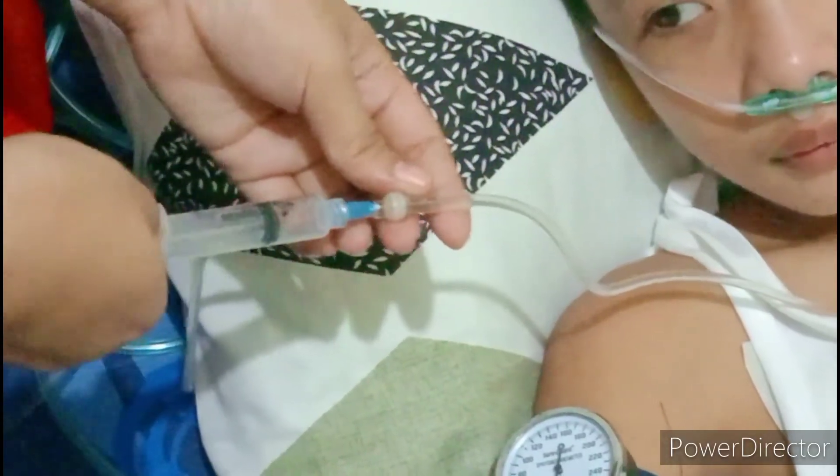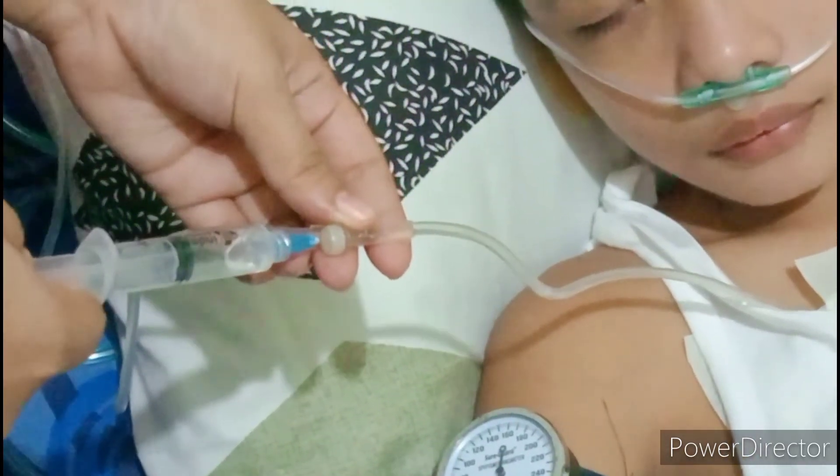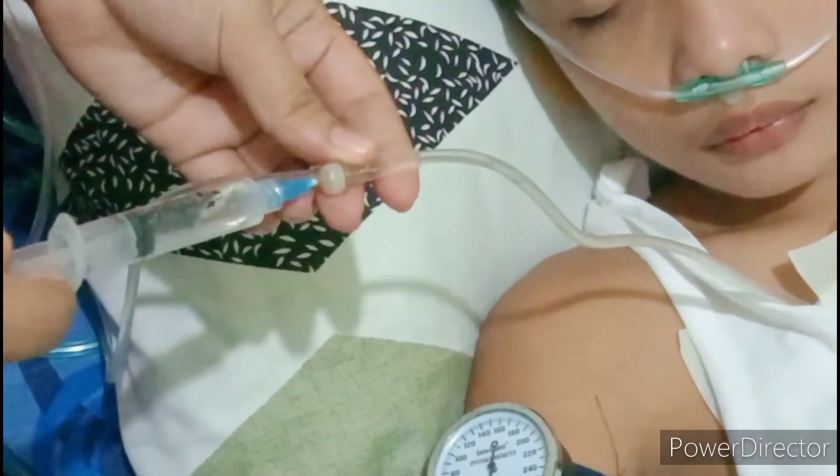Check the IV fluid to confirm it is running well. Then flush the central venous catheter to ensure patency.